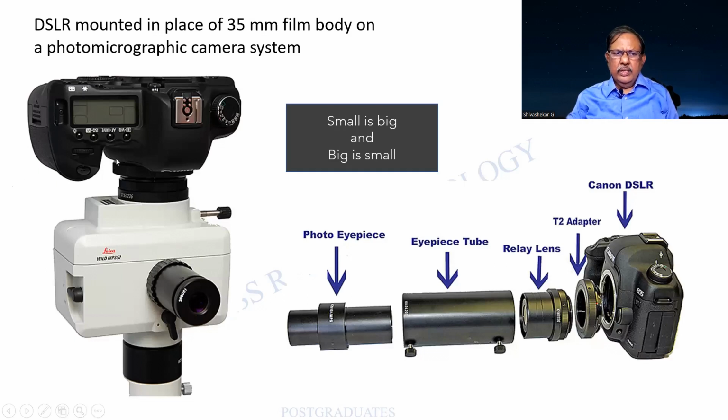So this is the camera that I had been mentioning. So you find that there is a viewer over here from which you can view the image that is being focused from the microscope. And finally, there is a click and the image also will be coming over here so that when you make the adjustment, this becomes sharper, just as you are using the fine adjustment in your microscope. Also, look at this one. So there is a series of these objectives and lenses. And ultimately, you find that there is a photographic piece that picks up the pictures and transfers it to the camera.